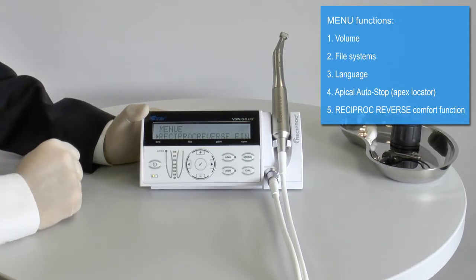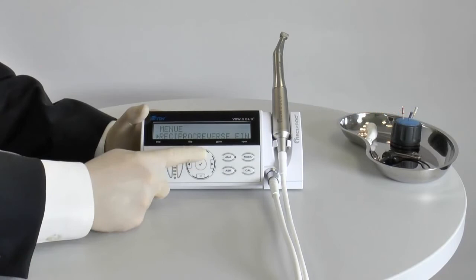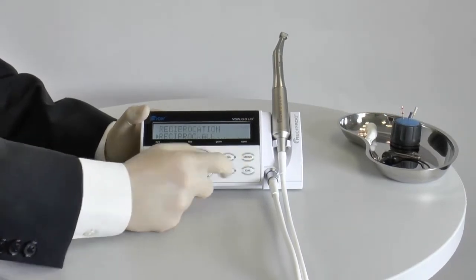An additional function is the reciproc reverse comfort function. This two-step indicator gives early feedback in the case of increased friction of the reciproc instrument. It is especially helpful for new reciproc users.